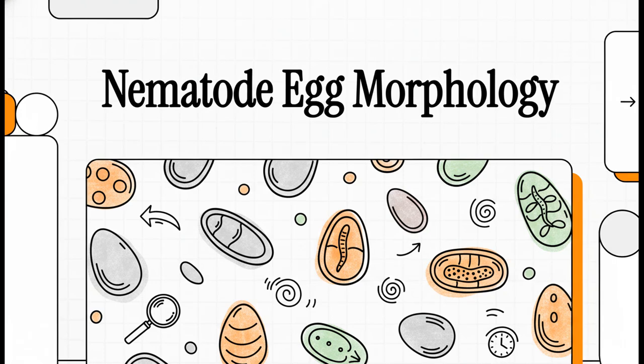Hey lab experts, welcome to this explainer. Today, we're going to build and really refine those rapid visual identification skills for nematode eggs using actual direct clinical data. If you're spending your days hunched over a microscope, you already know that speed and accuracy are literally everything. So let's sharpen both, shall we?